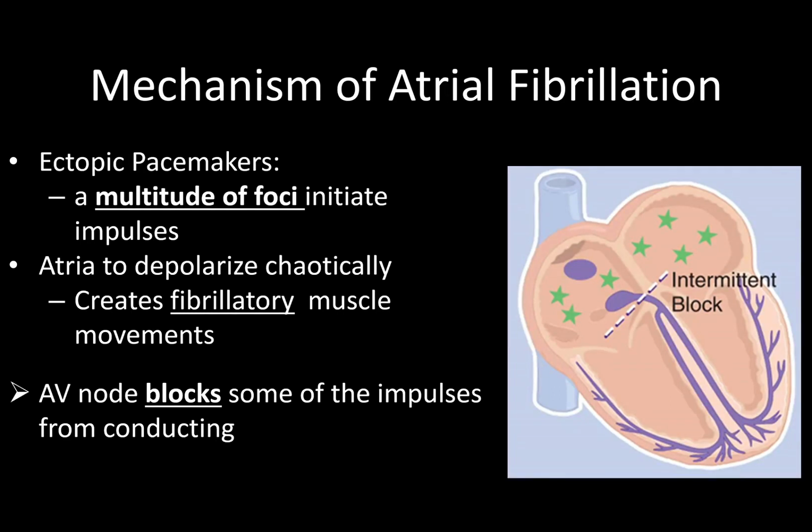Okay, let's talk about atrial fibrillation. This one's really neat because you have ectopic pacemakers. It's actually a multitude. The best example I can give you would be like raindrops on a puddle. It's just pure chaos, right?